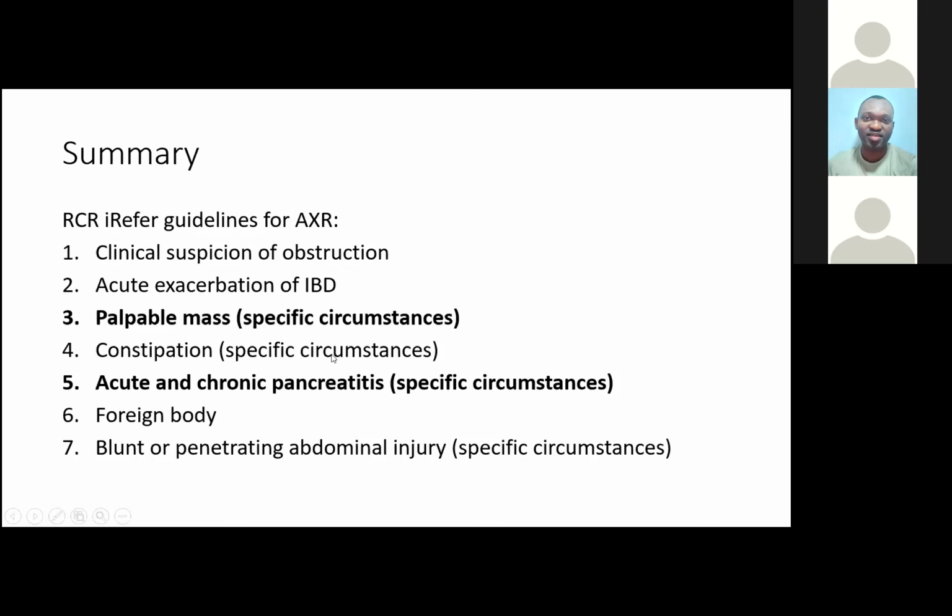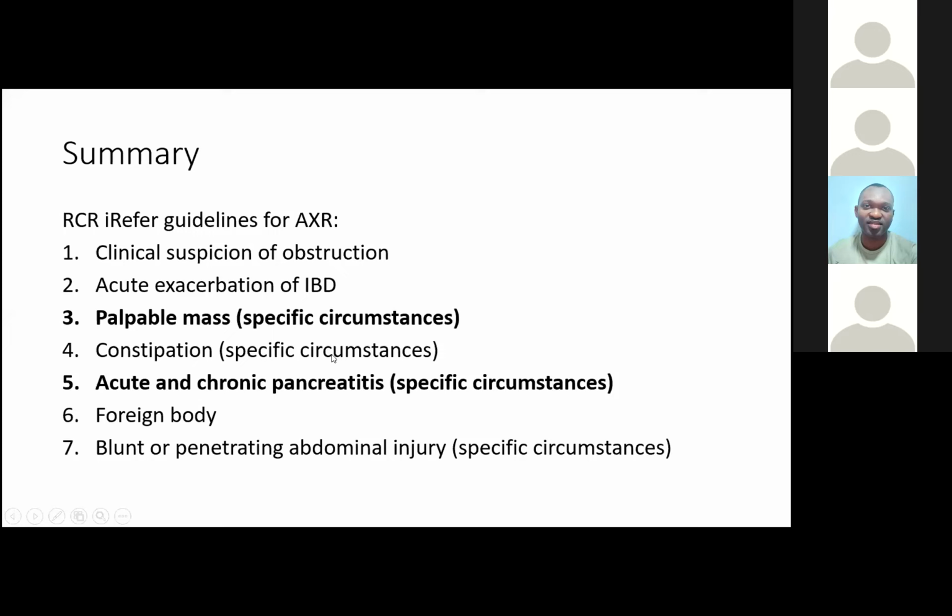Don't take shortcuts. The problem a lot of the time is that people see obvious pathology, and your eyes get drawn to it. Then your mnemonic or shortcut goes out the window. What you want to do mentally is register that there's pathology there, but then put it out of your mind, go through your normal routine, and then come back to the pathology. In most cases, you'll find you have a better, more complete picture that way, rather than focusing on just what's abnormal.